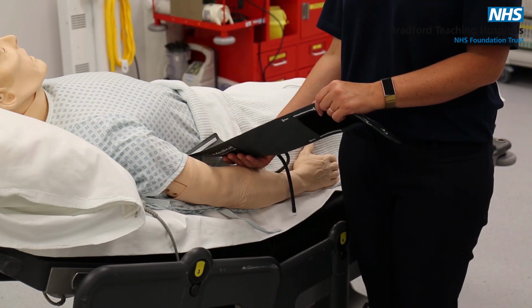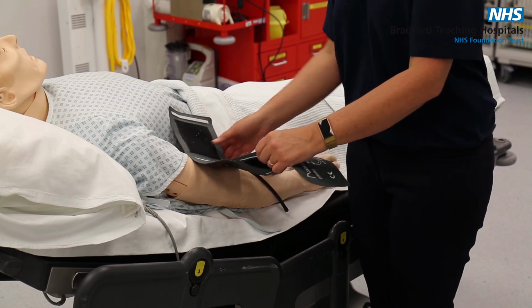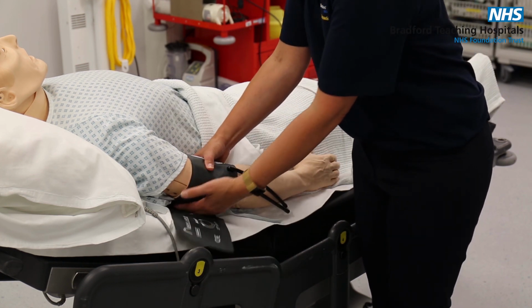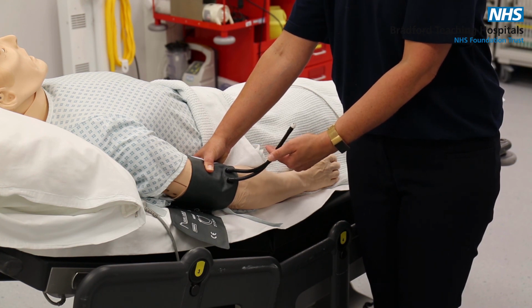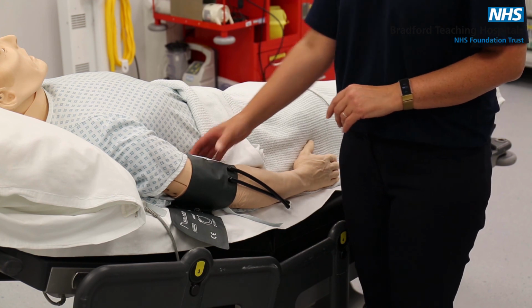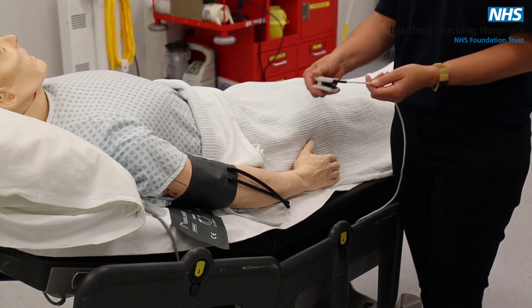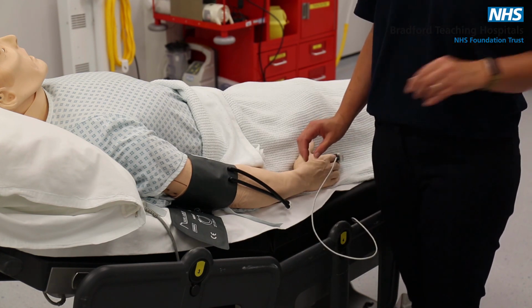So if as part of your patient assessment you wish to record observations, you need to put a blood pressure cuff onto Simman's arm. You don't need to attach this to anything, as the person controlling the mannequin will realise that you want a blood pressure and this will be displayed on the monitor. However, you do need to attach the SATS probe onto his finger for the result to be displayed on screen.